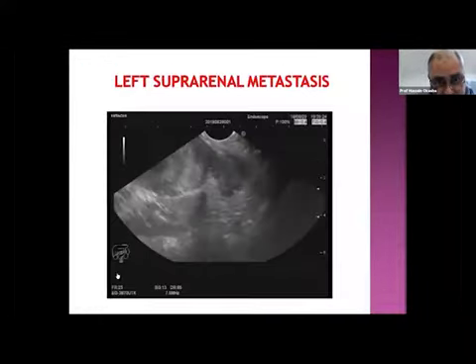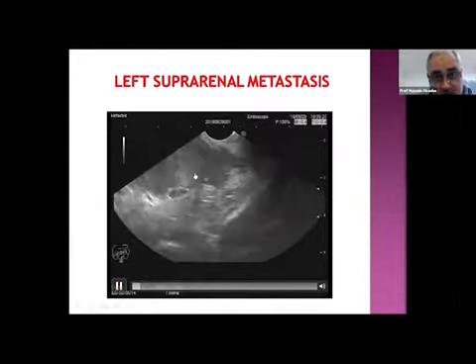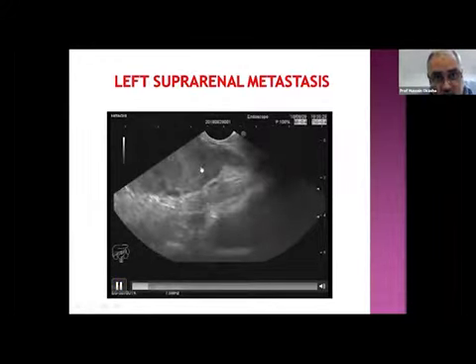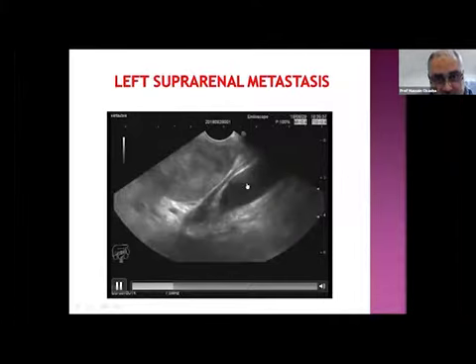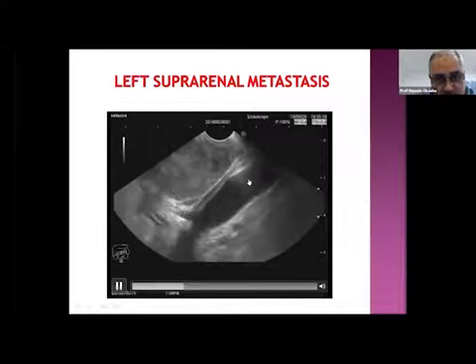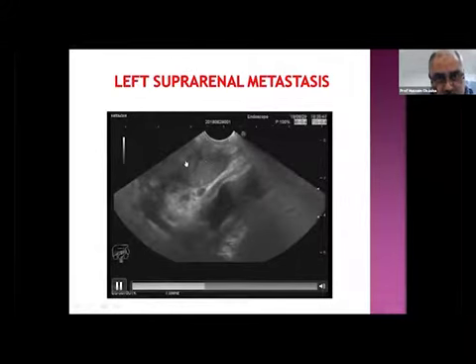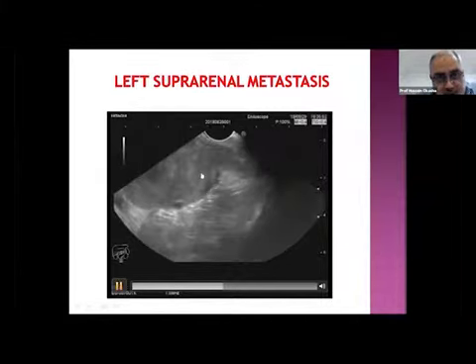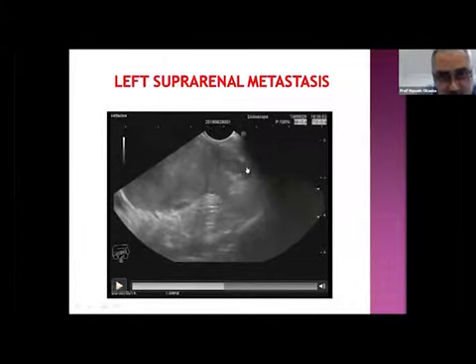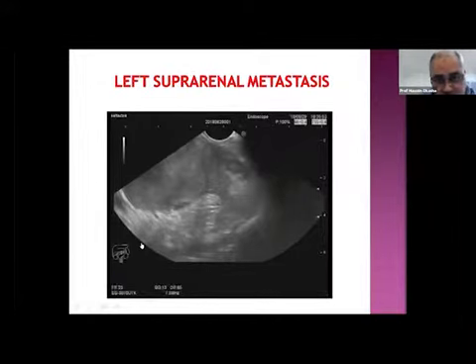Now let us see a patient with a very large mass — irregular, large, heterogeneous, with areas of breakdown. The kidney, IVC, and aorta are also visible. This is a large, ill-defined, irregular-border mass with areas of breakdown, nearly completely distorting the shape of the suprarenal glands. The wings of the suprarenal glands are no longer identified — distorted and destroyed by the invading mass. These are the four main differences between benign and malignant suprarenal masses.